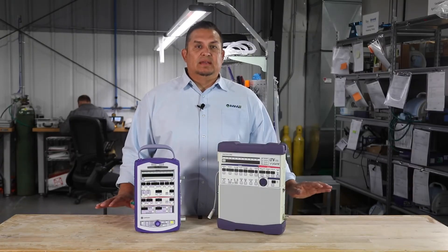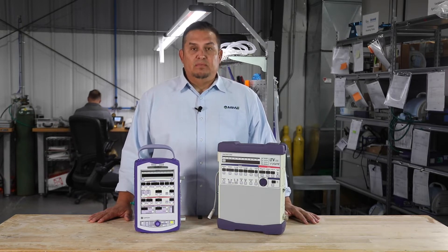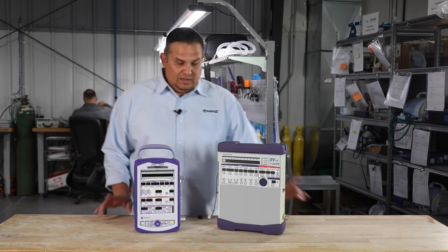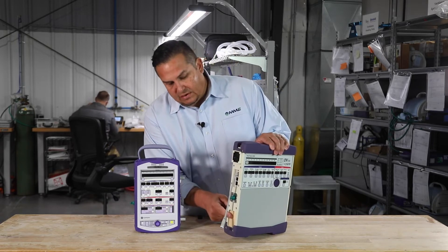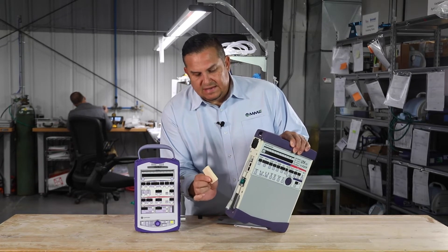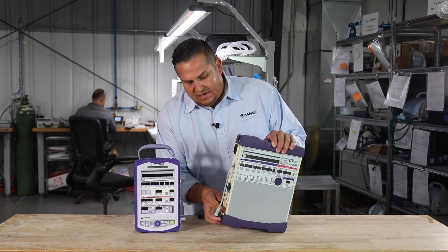Now that we've seen everything that comes out of the box and talked a little bit about accessories, let's talk about preventive maintenance — little things that can save you a lot of time and money. These small filters, a little fan filter and a little intake filter, if properly taken care of, can save you a lot of headache, time, and money. This filter right here is nice and pliable — real soft, a little stiff but still pliable. That's brand new.